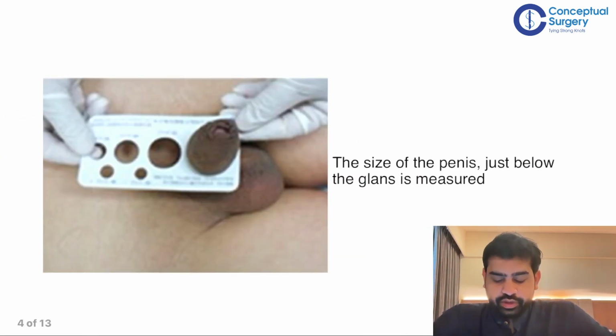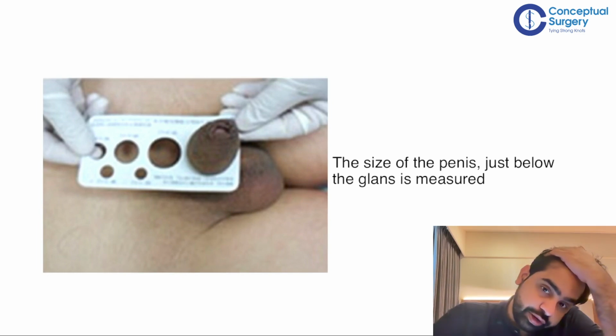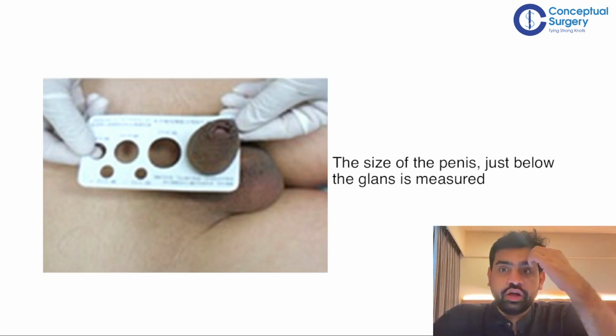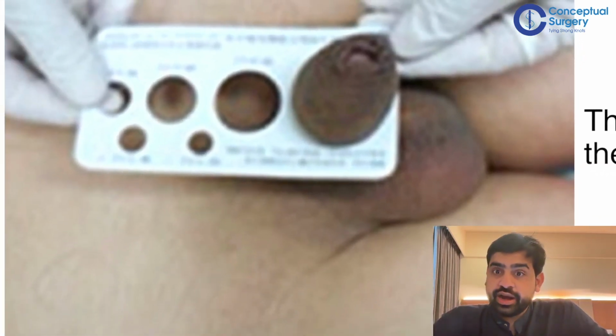Now there are various sizes of staplers available. Before opening the stapler that you have to use, you need to understand which size stapler has to be used. For that you have this particular scale. Now please pay attention. How do you measure this size? You have to measure it at the level of the corona, the coronal sulcus.